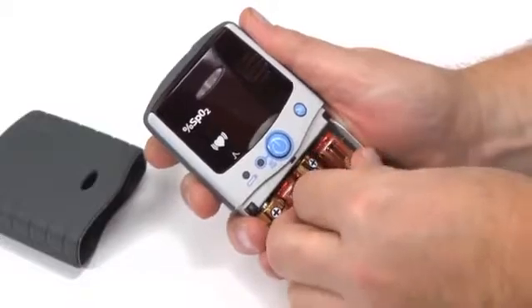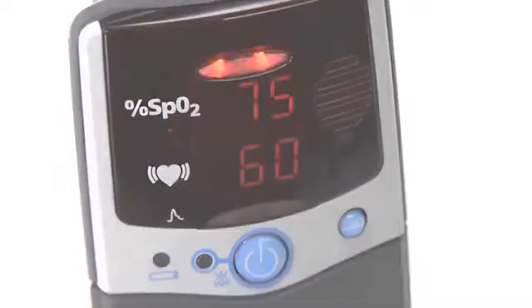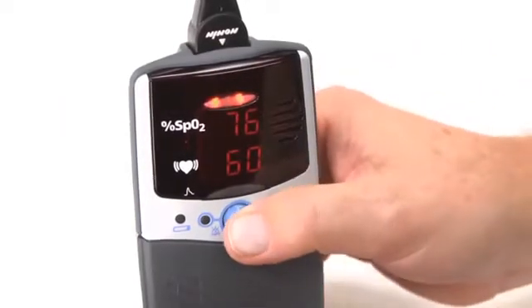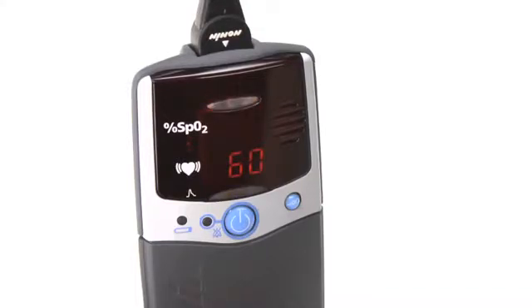Remember, replace the batteries within 30 seconds to retain the clock, date, and alarm settings. For the 2500A model, your oximeter has audible and visual alarms that can be set to signal if either oxygen saturation or pulse rate exceed the predetermined ranges. If either of these occurs, the oximeter will sound a three-beep, two-beep audible signal that will repeat every 10 seconds, and the condition that is out of range will flash. You can silence the audible alarm for two minutes by momentarily pressing the on-off button, and you can restore the audible alarm by pressing it again. When oxygen level or pulse rate return to the preset range, the alarm will stop and return to normal monitoring function.